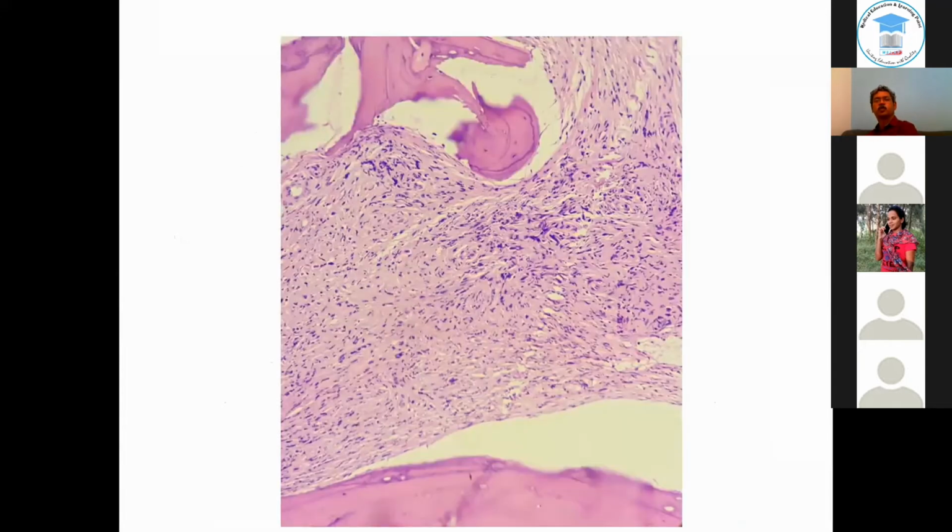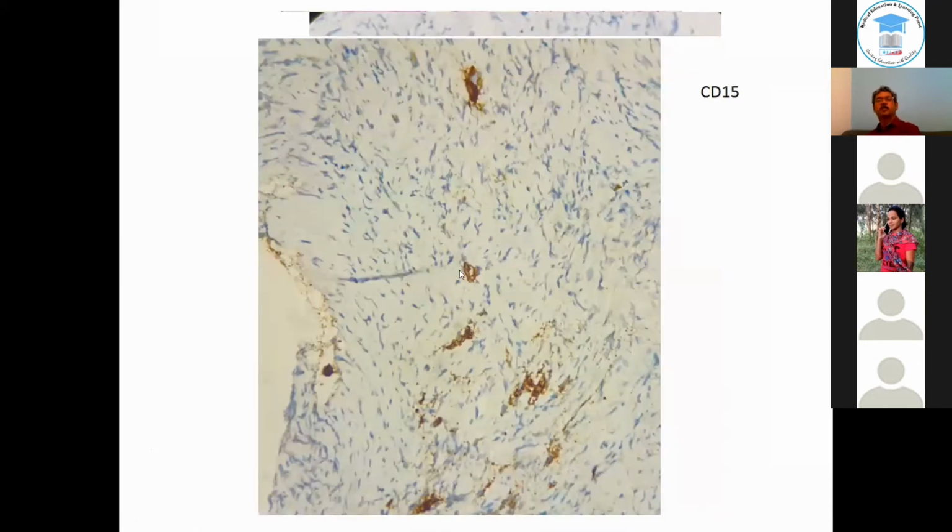And I'm grateful to Dr. Jayashree and Sudipto for sharing this case with me, where they have this patient with Hodgkin's with a lot of fibrosis in the bone marrow, but apparently no RS or mononuclear cells. But when they did a CD30, there were some cells which stained positive, and a CD15 stained more cells.